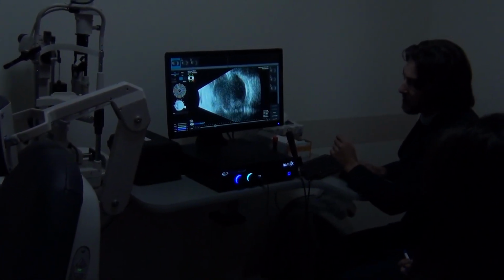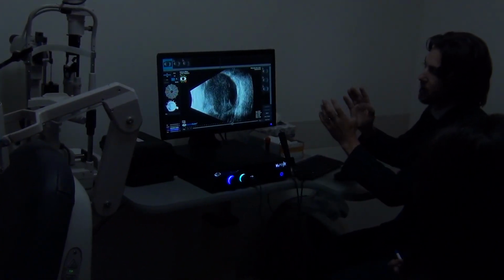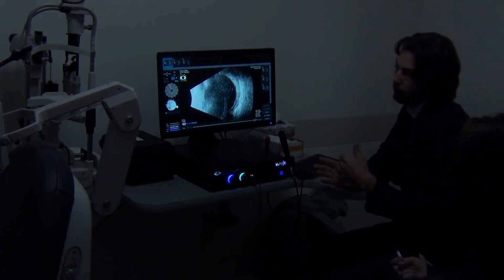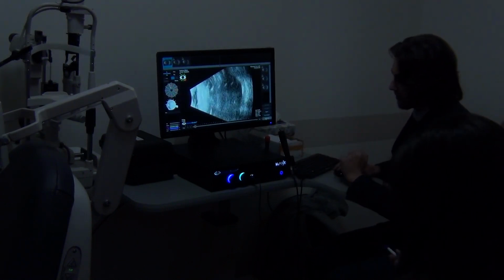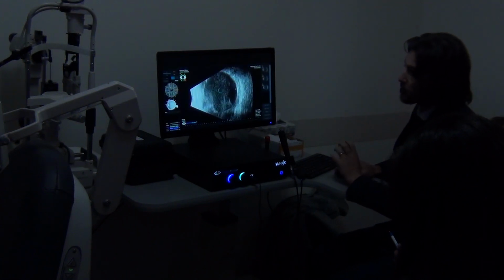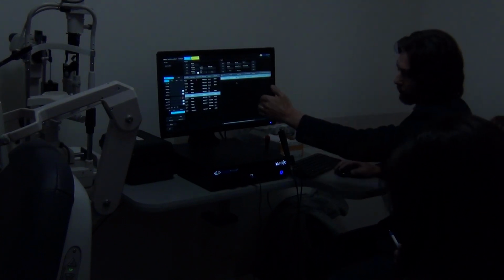Also, with the B scan, you have different scanning tools, where you can choose basically a different view. So it will be the retina view, orbit view, vitreous view, or a general scan view. So it's also available from the screen. We'll go over it in detail later on. So I will close this exam. It's one type of examination which you can look for, right? So find the patient and review the exams.